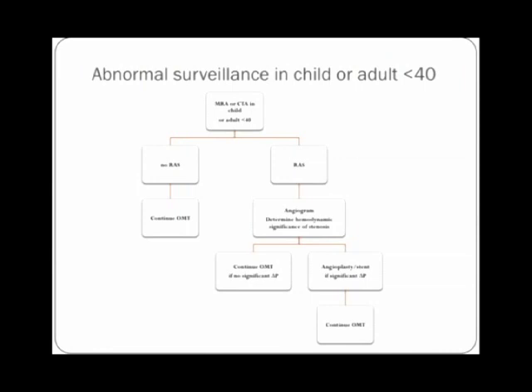What you really have to do, these patients have already failed. There's no other choice. So you either go on with failure and progress on to worse chronic renal artery disease or into dialysis, or you treat. So you're starting at that point. That's not the end point, that's the start point. You're not taking a look at the failures.